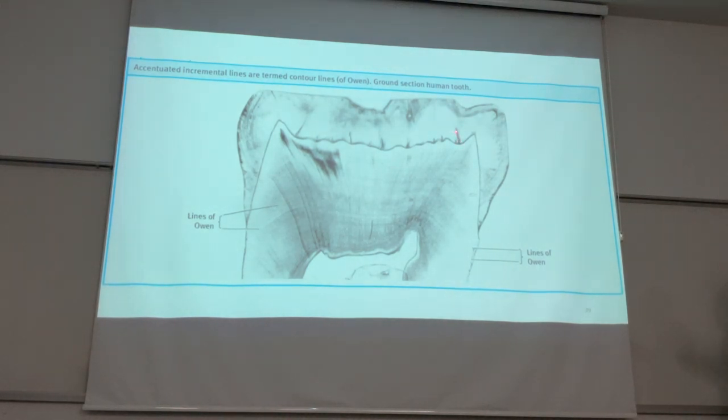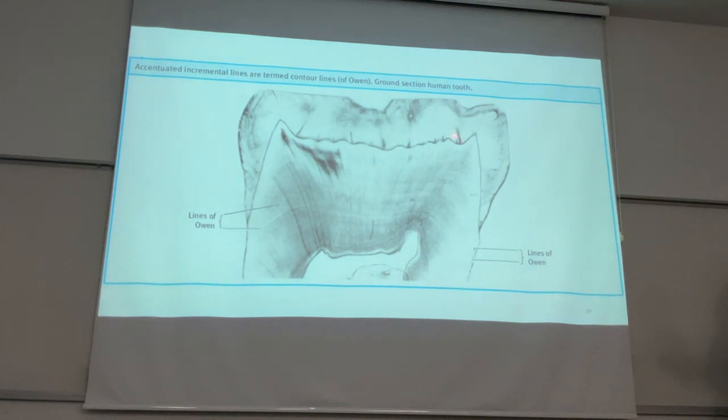What is the name of this structure? Lamellas. Start from enamel side and come here. Spindles continue with the dentin outside. This structure is tufts. The remains is tufts, and we don't have other option. In our exam, again, I can ask about this structure. For example, give you this picture and ask about this part. Okay? You should know this is a tuft.